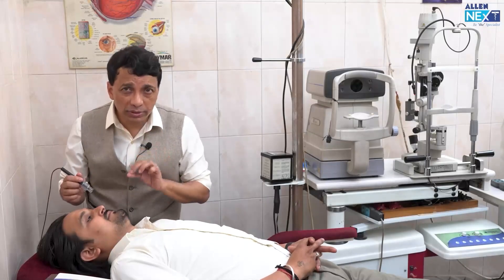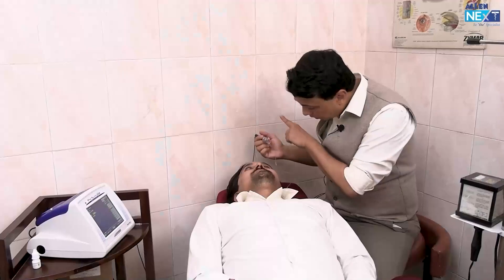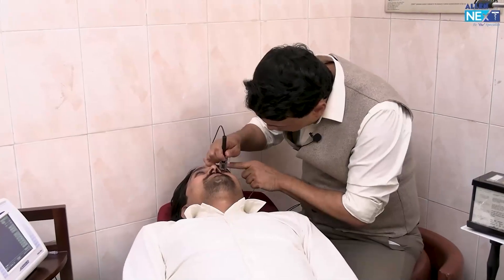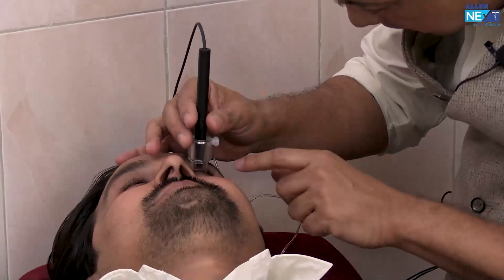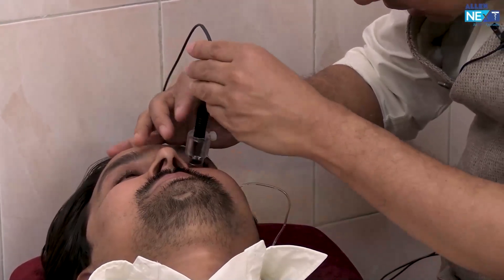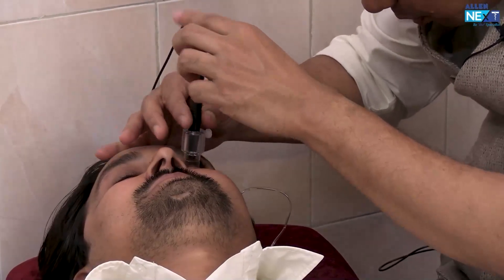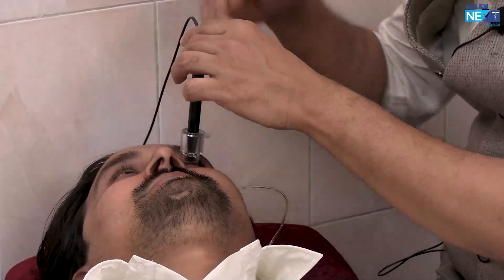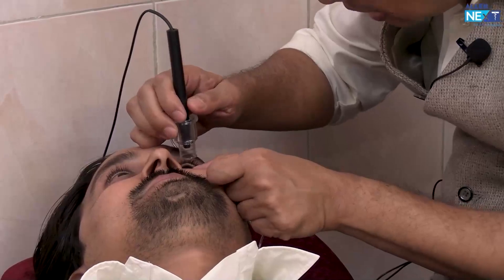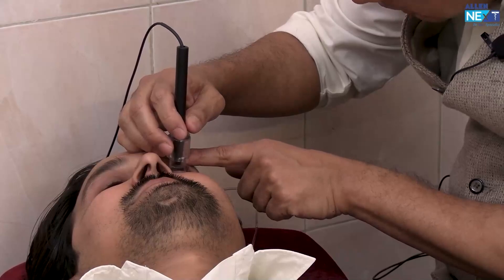You have to go very gently, very delicately, without traumatizing the cornea or the patient's emotional psyche. We ask the patient to look up — whatever is more comfortable — and I insert the flange of the cup very gently. Now we have placed the probe squarely and as perpendicular as possible right inside the eyelids. Be careful not to press; place your right or left hand on the forehead so as not to apply pressure on the probe.